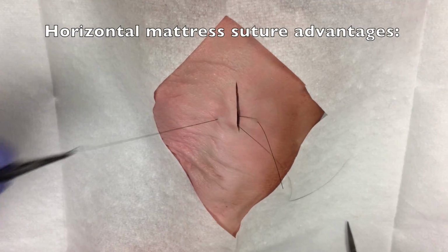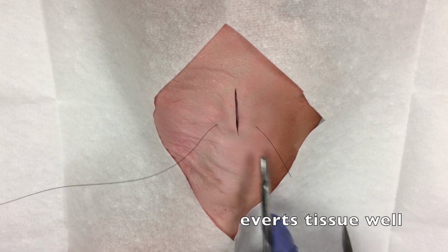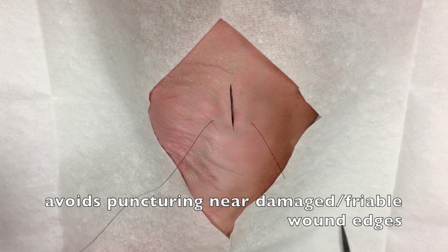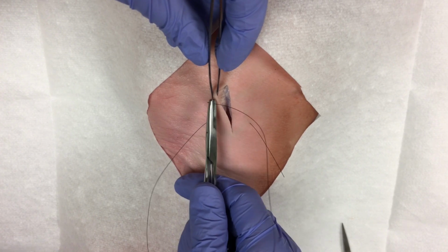The advantage of this suture, as with any horizontal mattress suture, is that in taking larger bites, you are able to achieve better eversion of the skin in the center and also avoid puncturing any macerated or damaged tissue.